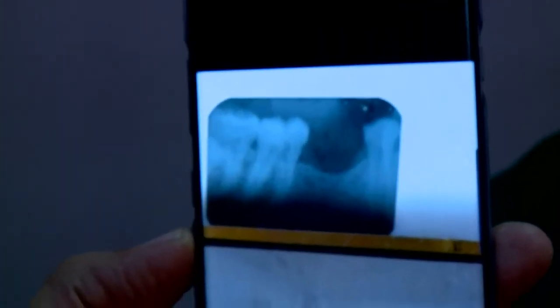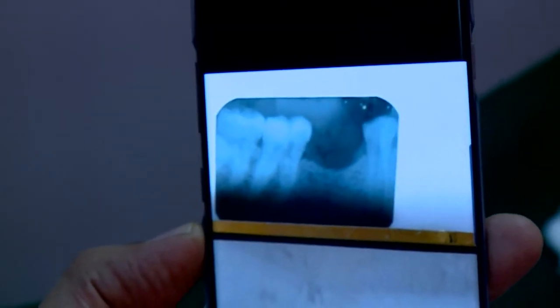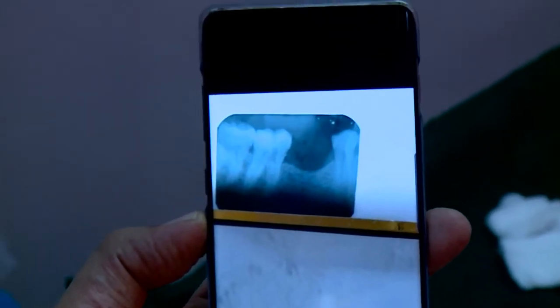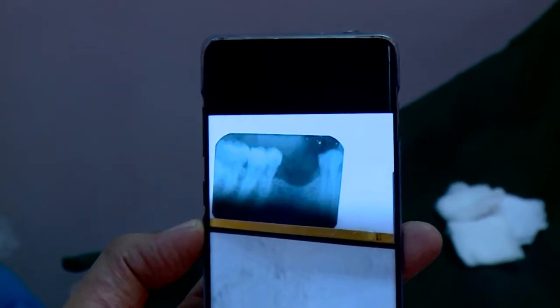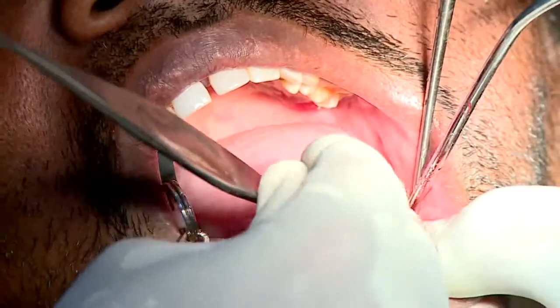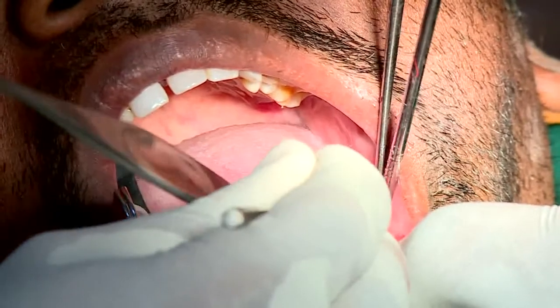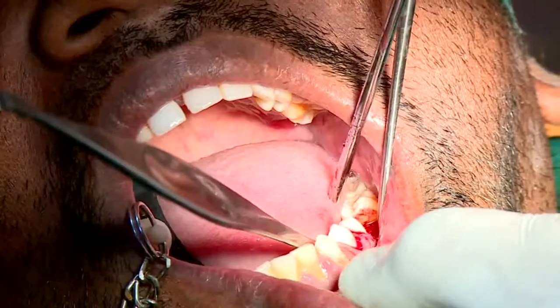As you all see from this IOPA image, there is a lot of crestal bone loss. And we can't really see the position of the nerve. But what is available is easily about 15 millimeters of bone, available from the crest. At this particular juncture, I think our people have already done a marking, and we are actually planning to place a 3.75. So you can see, can you focus this one, please?